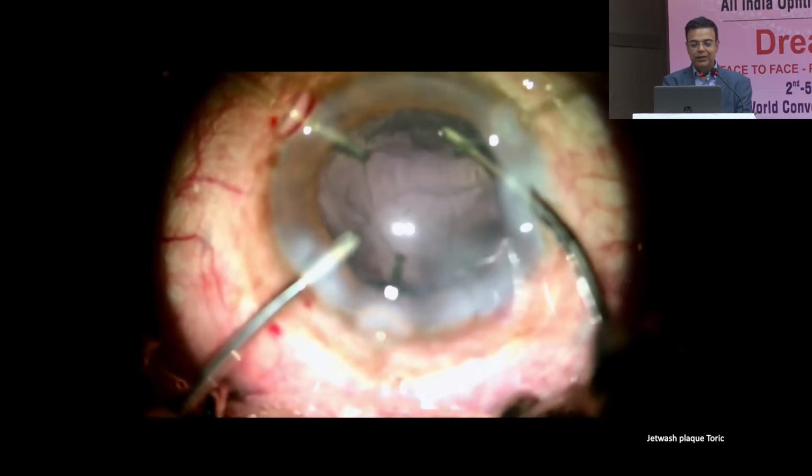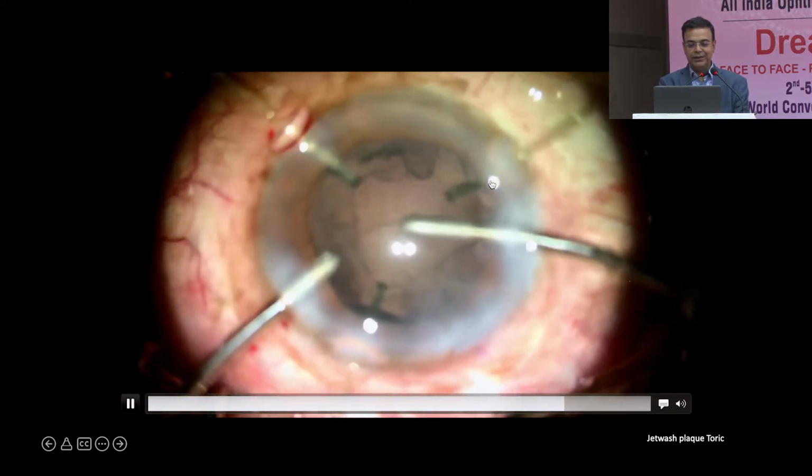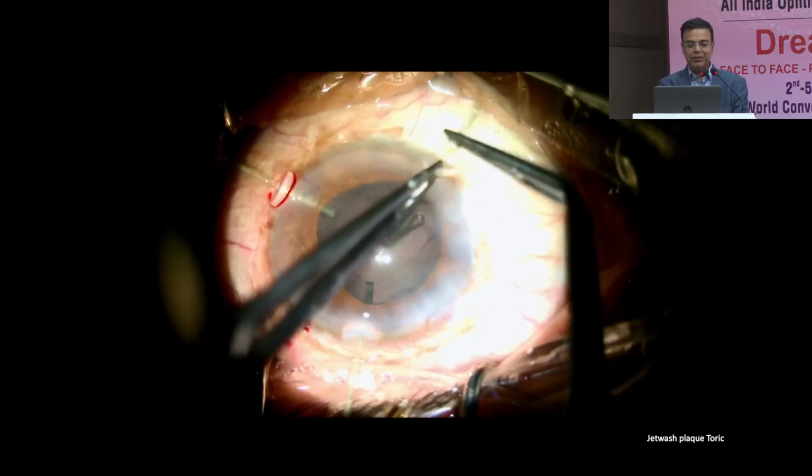So I went there, and the mistake is that I'm going too far. My rhexis is small, and with my bimanual handpiece, instead of using this hand to go there and aspirate, I've gone from this side and I break the rhexis. So all that hard work goes to waste because this patient was planned for a toric IOL.